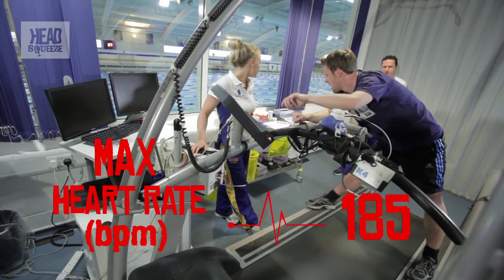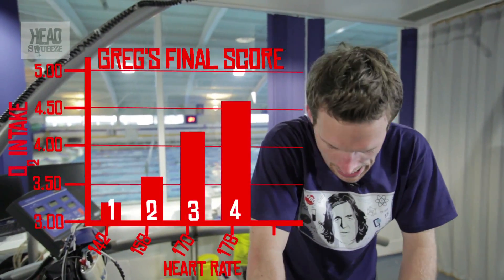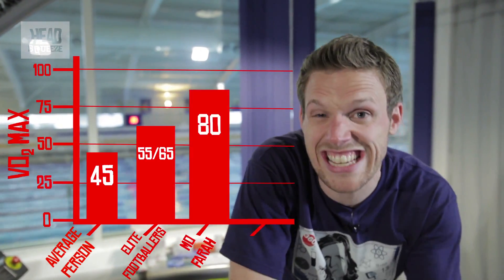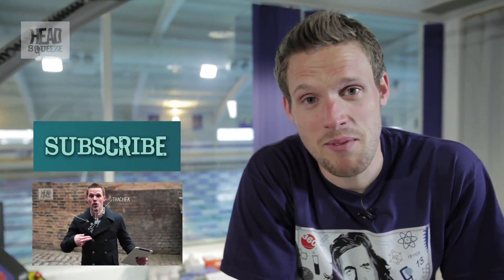Your maximum heart rate got to 185 and the amount of oxygen was 4.65 litres. So we've crunched all the numbers, and from all that data and my body weight, we've come up with a VO2 max score. The average person is probably about 45. Elite footballers are probably between 55 and 65. Mo Farah is probably at 80 and above. Today I scored 58 — so pretty chuffed with that. From that we'll come up with a training regime, working out exactly what levels I should train at to increase that VO2 max score and increase the time I can stay in the aerobic period. So that should answer the question of how fit — or indeed unfit — I am. Until next time, happy head squeezing.